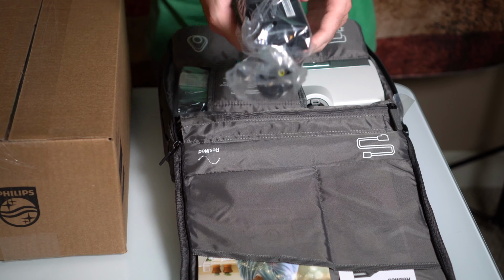Now, if I'm getting set up someplace and let's say this isn't wrapped up in plastic, say it does look used, and even if the therapist tells me, oh, I was prepping everything for you before you got here. Listen guys, you're your own advocate, it's your money. I say, you know what? Go get me another machine.